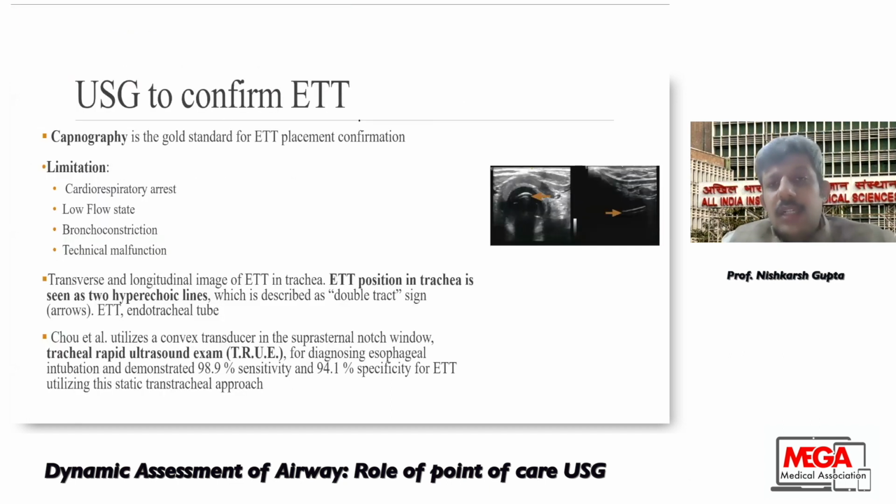Then another important issue is that when you are intubating, especially in emergency situations, you may not be able to appropriately judge whether the intubation has been done properly. We all know capnography is the gold standard and it mostly helps us, but sometimes in critical situations, either you may not have it or you may be having a false reading.